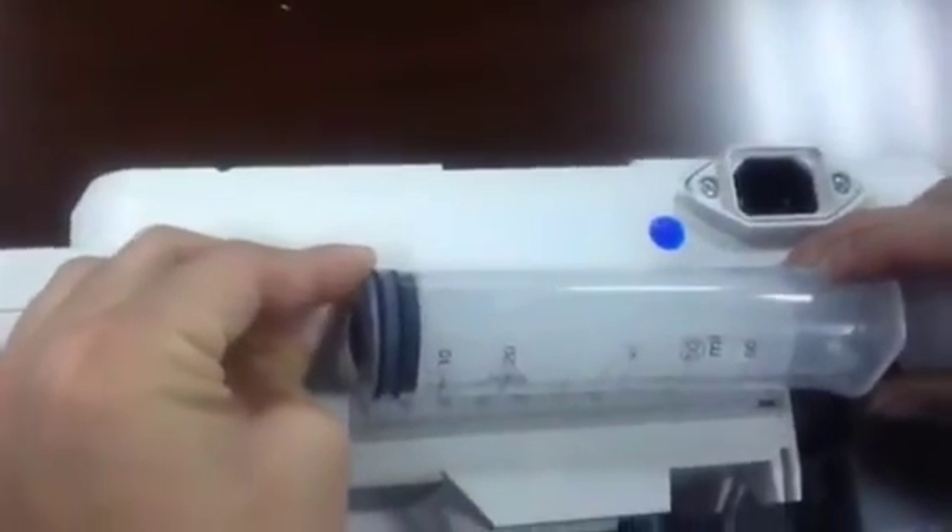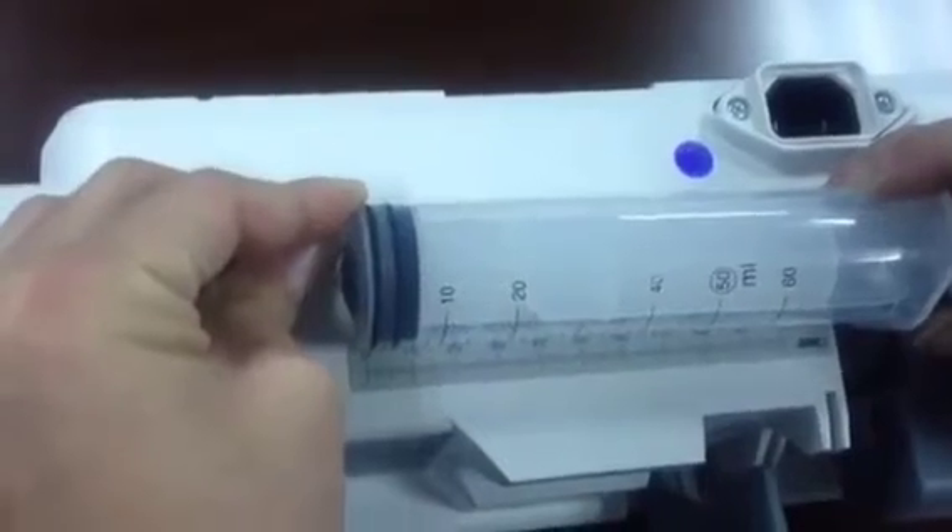For the 50 mL syringe, measure the length. There's a ruler on the side of the syringe — measure the length from 0 to 50. It reads 75 mm. Record this value on paper.